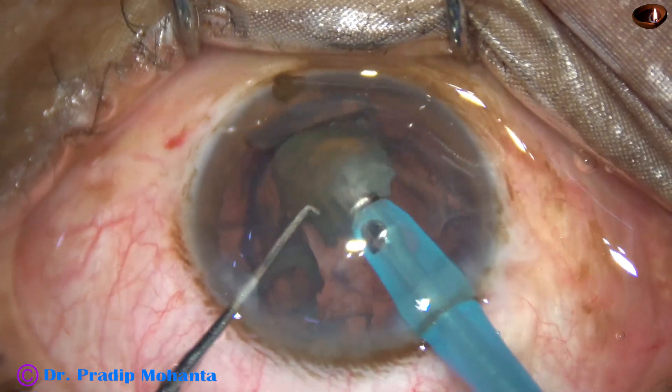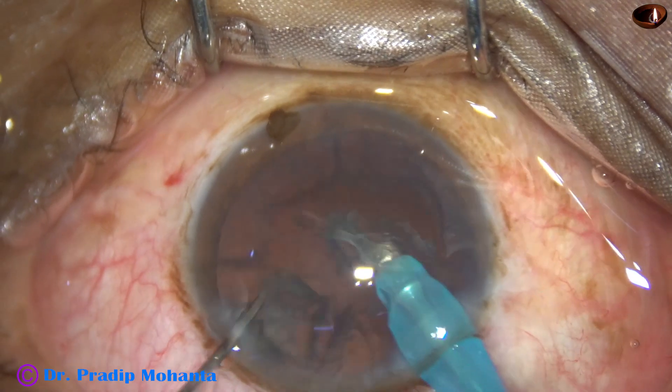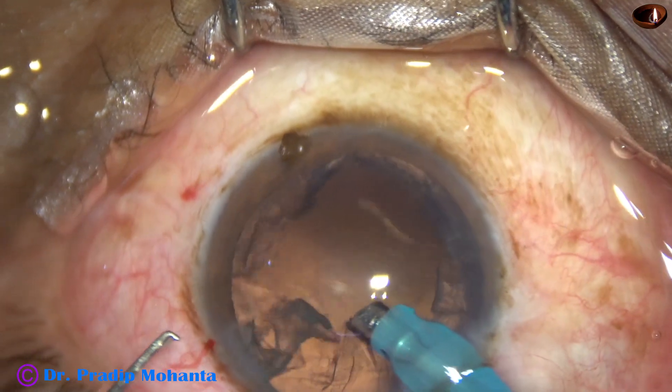Ultrasonic energy used in this case is about 50 percent. Flow rate is 45 ml per minute and vacuum is 450 mmHg.